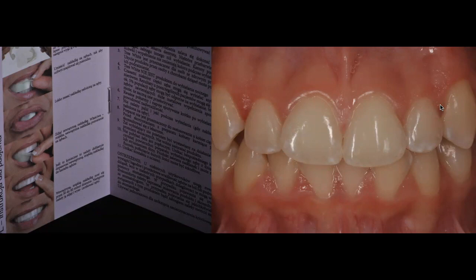So the only thing that we did is that we modified the way that we told her: you have to use mild pressure. We taught her how to do it. We made sure that we did it in the office one more time for her so that she can see what mild pressure looked like. And if you have any gel going through the tray, you know that you used too much pressure. You have to be careful the next time that you use it.